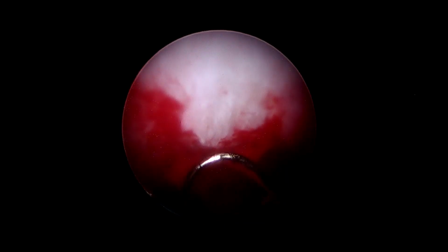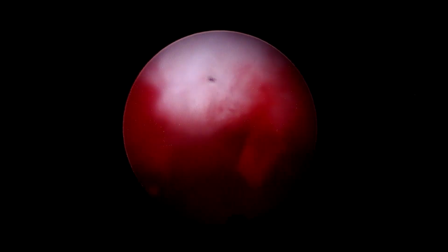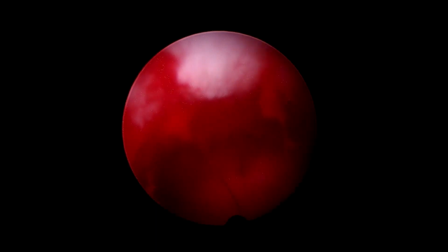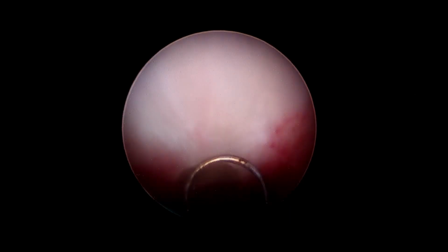Now we have gone inside with the help of the bipolar resectoscope. One thing you have to be very careful about is to excise only the scar tissue and not go beyond, so as to avoid excess injury that you might cause because of the resectoscope. So you have to be very superficial and excise only the scar tissue. This is an 18.5 French bipolar resectoscope we are using to excise the scar. It is advisable to use a bipolar resectoscope over monopolar resectoscopes, but if somebody is using a monopolar resectoscope, that is also fine.